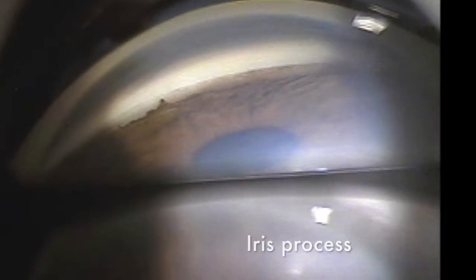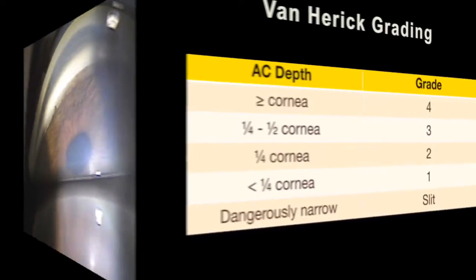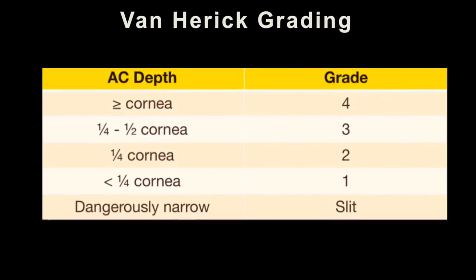The insertion of the iris and peripheral iris configuration is important to note. In uveitis, peripheral anterior synechiae are found, which are solid, sheet-like, and composed of iris stroma. They obliterate the angle recess, whereas iris processes are fine, lacy, and do not obstruct the flow.